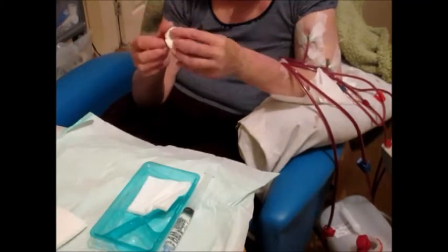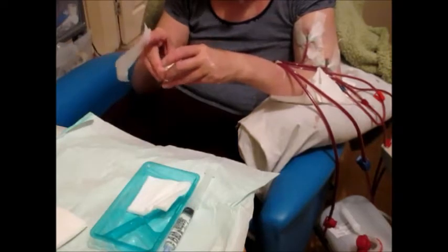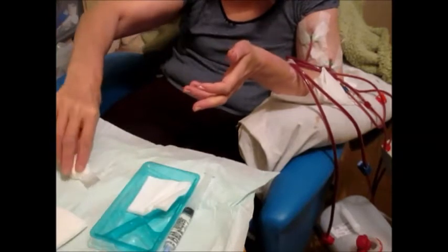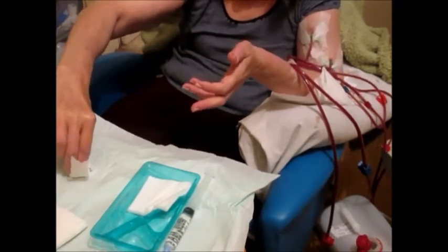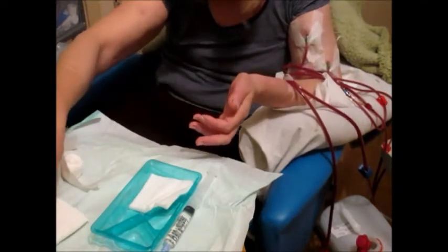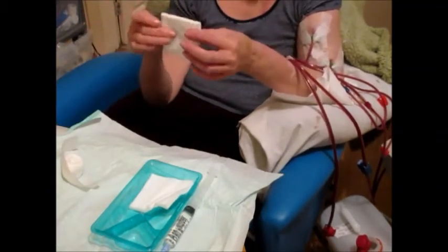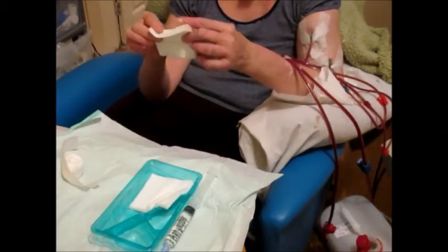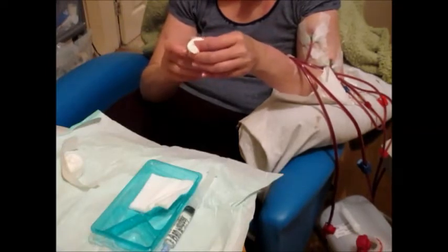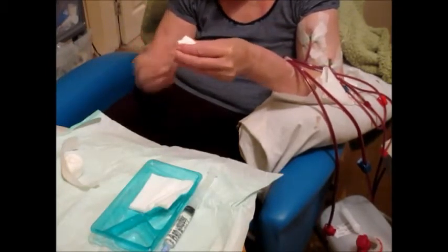The swab that I'm creating for the removal of the arterial fistula needle I tend to make a bit thicker, because sometimes I do have a bit of excess bleeding there from the excess post-dialysis. So I tend to use about five swabs for the arterial and three swabs for the venous needle.